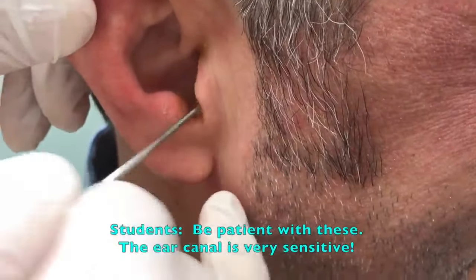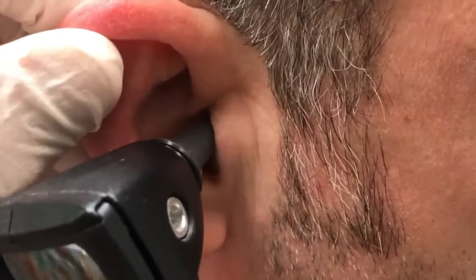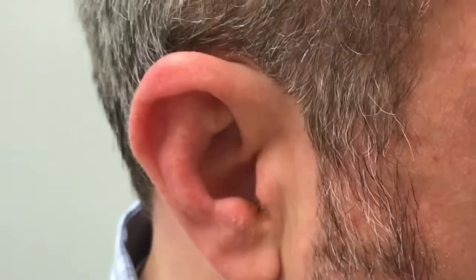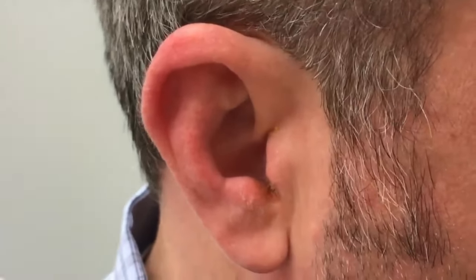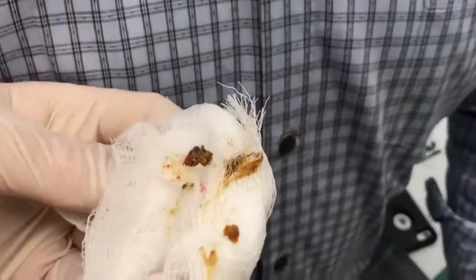Look at that coming out of there. That's huge. We just got another huge one. Sometimes what happens is the wax and dust will get in there. Oh yeah, you're clear now. I want you to see what came out of your ear there. Wow. Look at that. What happens is it gets in there and it'll dry, and it sort of attaches to the little hairs inside the ear canal. So when we scoop it out, it tears those little hairs out and it hurts a little bit.